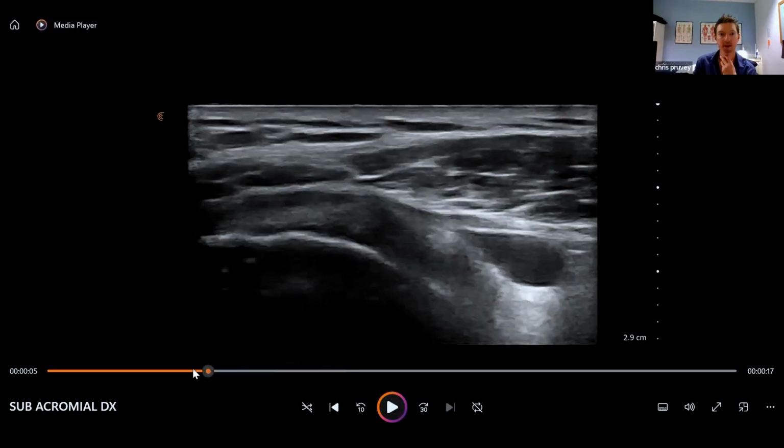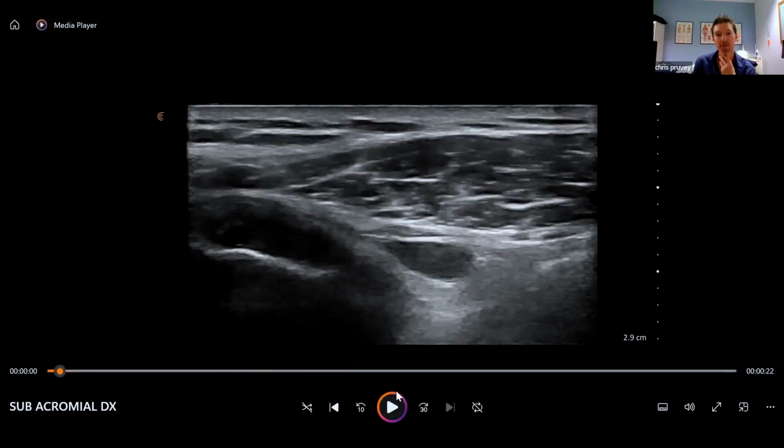Yep, back up. So this is an example of just a diagnosis, and then I'll show you the injection. This is a good example of what I might see on a scan. This is the bone, it's a shoulder, and this is the edge of what we call a supraspinatus tendon. The tendon itself looked good, so I went searching because this gentleman was in a bit of pain.